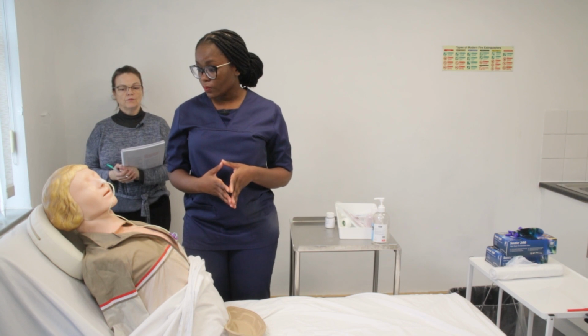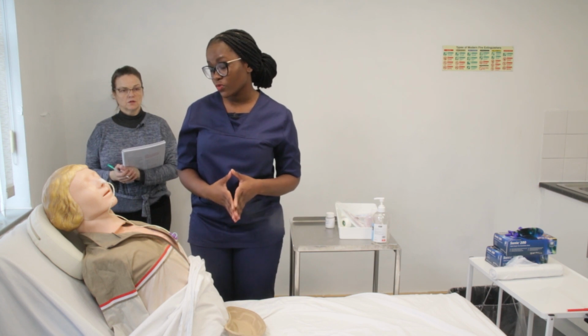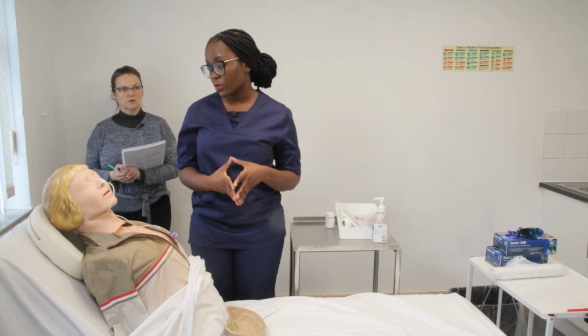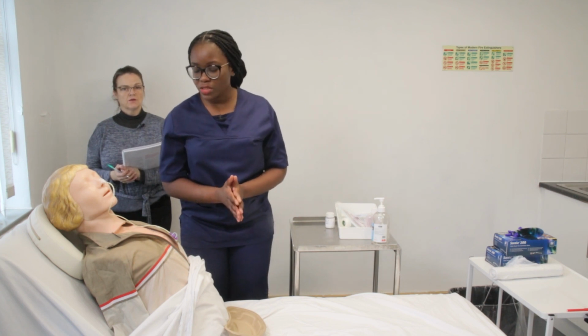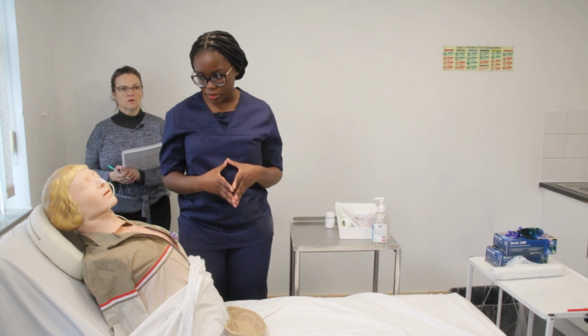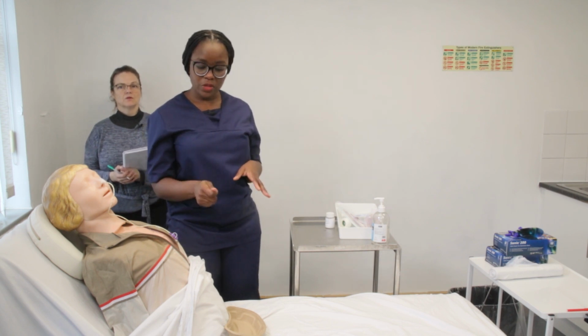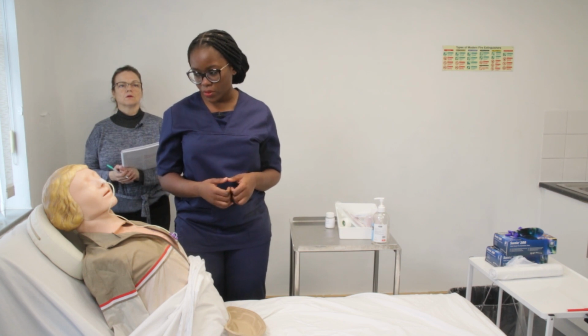Yeah, I think that's it. Okay. And what about the receiver? Do you want to keep a hold of it for a while, or do you want me to take it away with me? Keep that, please. Okay. I'm just going to leave it for now. And when you're done, we will discard it into the clinical waste bin. So I'll leave you now. This is the buzzer. Press the buzzer, and I'll come back to see you in about 30 minutes.